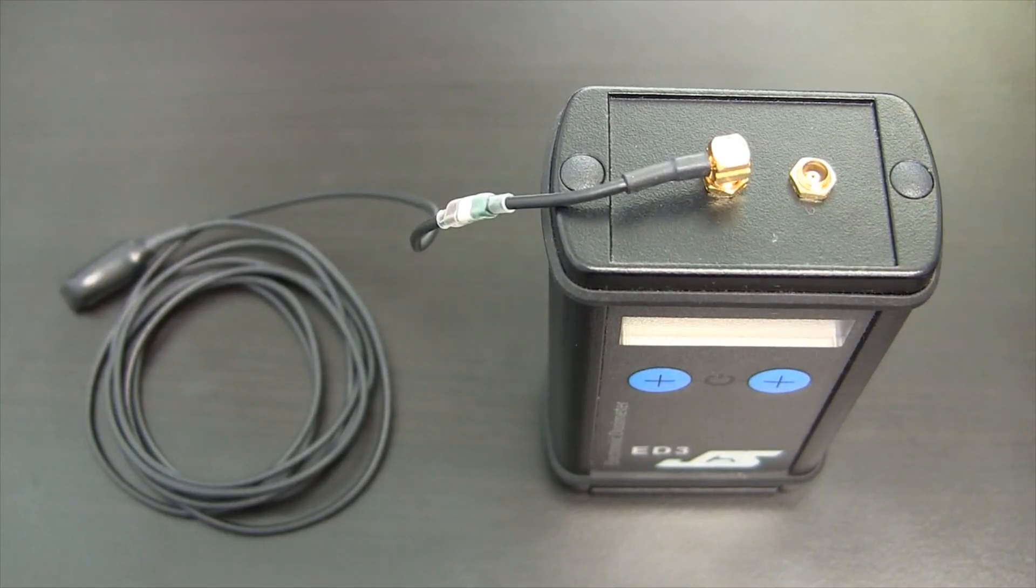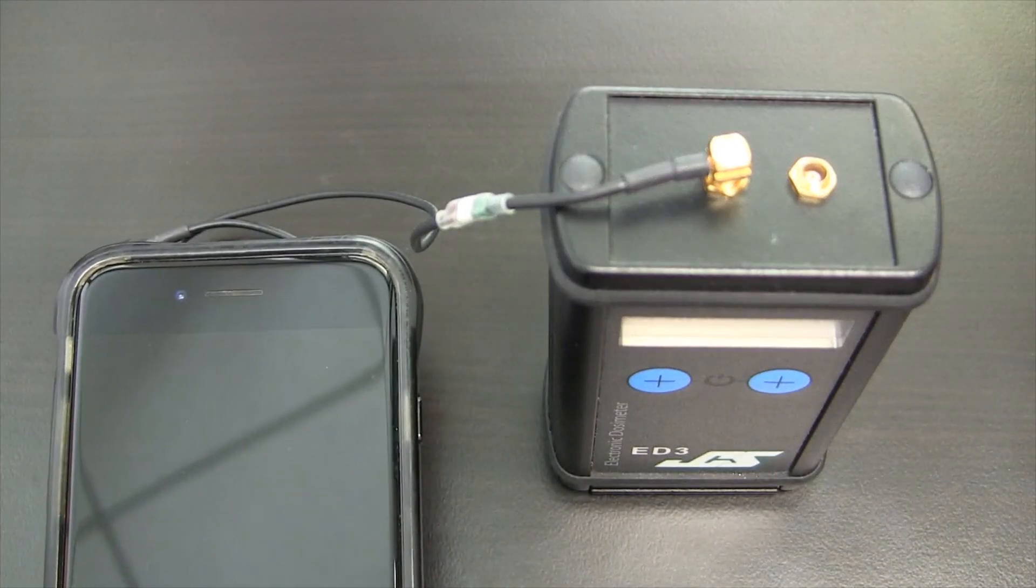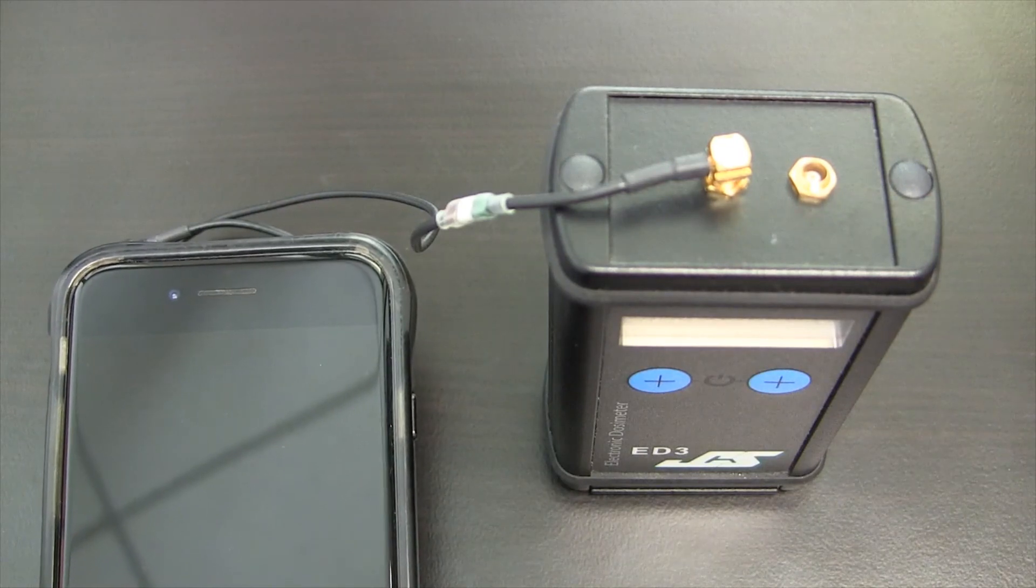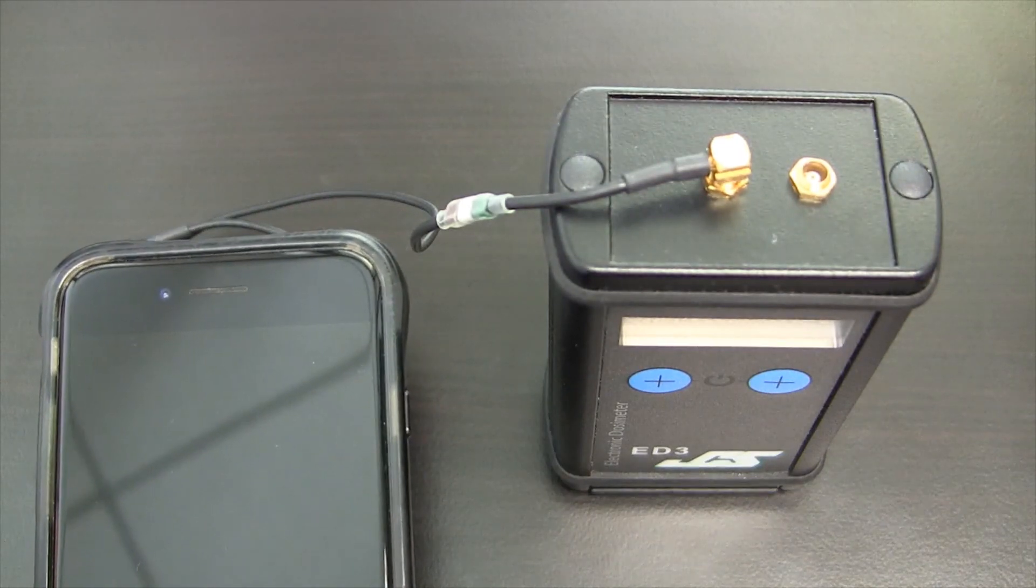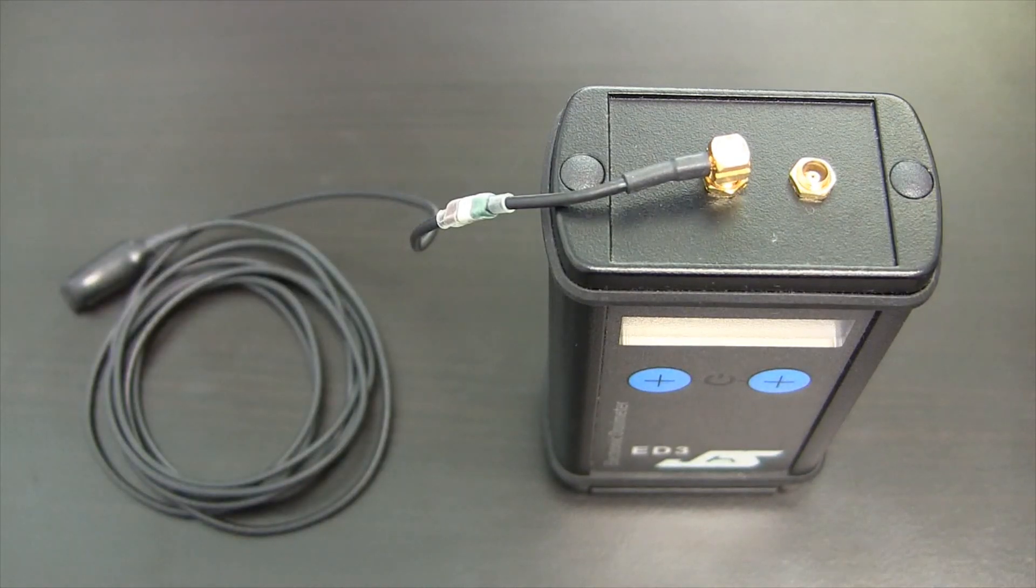When using the ED3 and the detectors, you want to make sure you keep the system outside of very high EMI environments. One example would be putting a cell phone very close to the detector because of the long lead. Even though it's shielded, the high EMI can cause interference and show up as counts inside of the system. This can also apply to other types of devices as well that emit high EMI, so it's best just to avoid them.